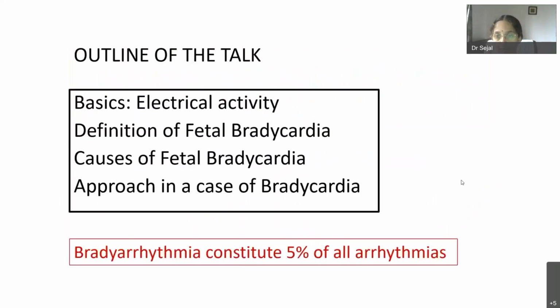Overall, bradycardia is much less common. The most common is irregular rhythm, including ectopics, and bradycardia constitutes only 5% of the total abnormal rhythms found in the fetus. So today we will see the definition, how you define fetal bradycardia, the causes, and an approach and management in short.